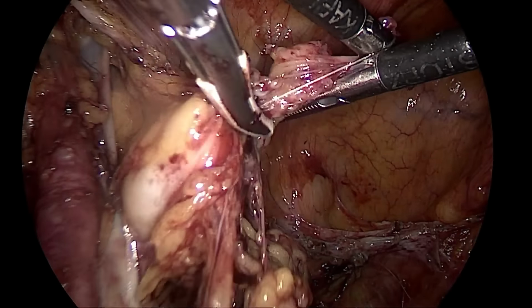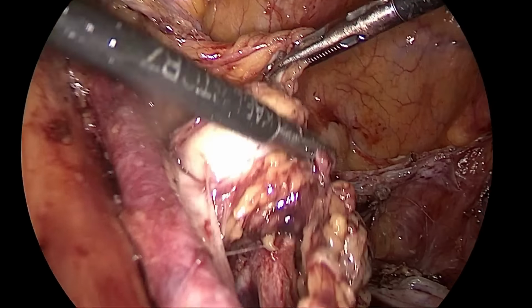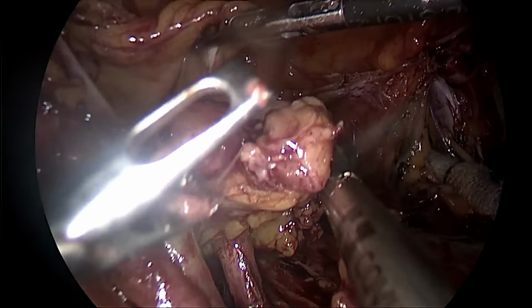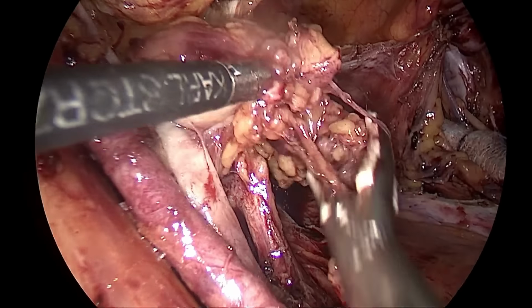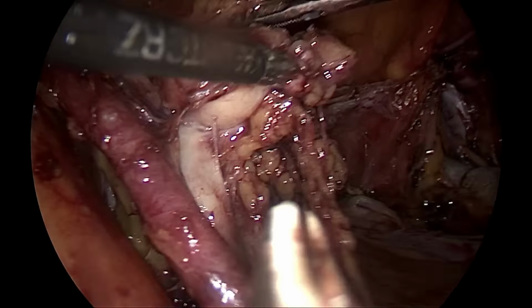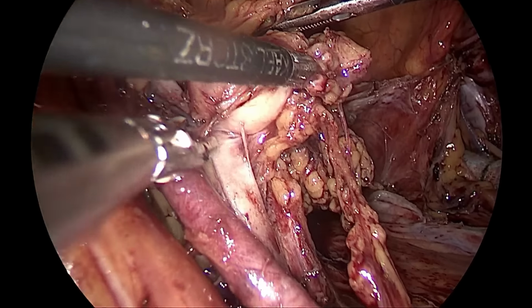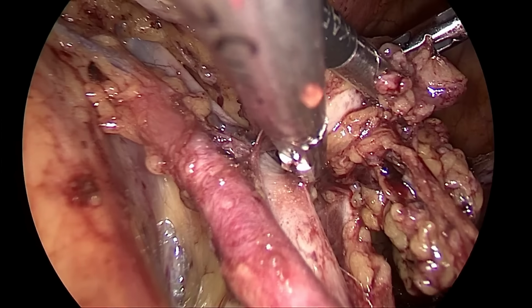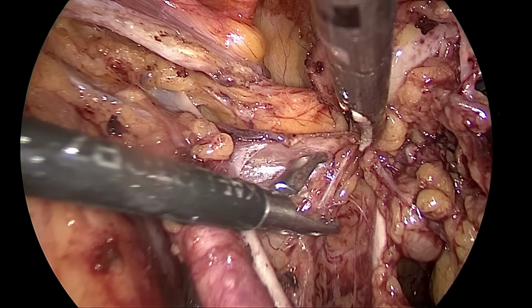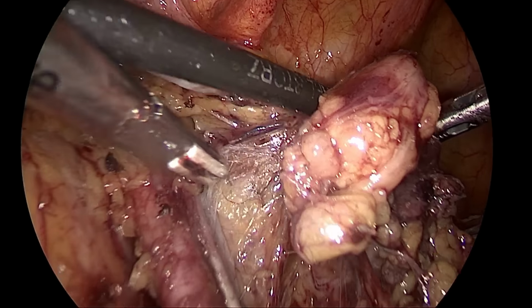So that's a very crucial area. And the vascular clamps and the sutures have to be ready in these types of cases where we are anticipating that the node is adherent with the vessels. But I got lucky in this case that the node got separated, so we don't need the vascular set in this case.